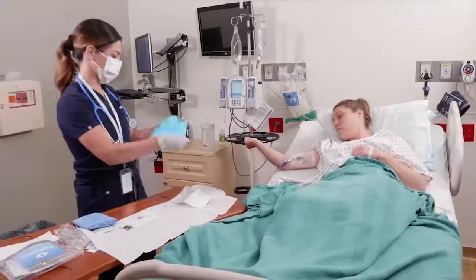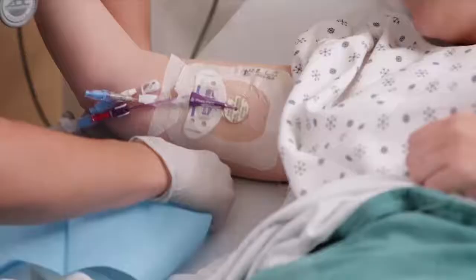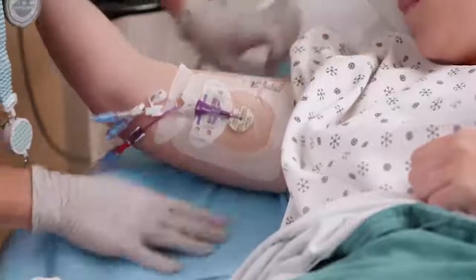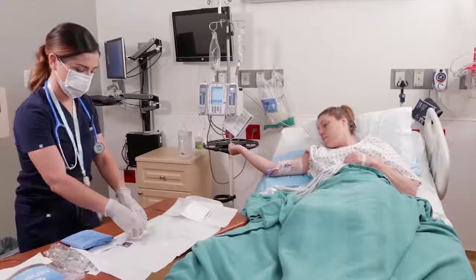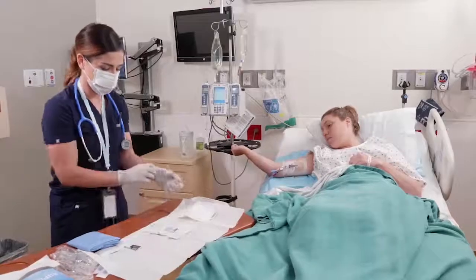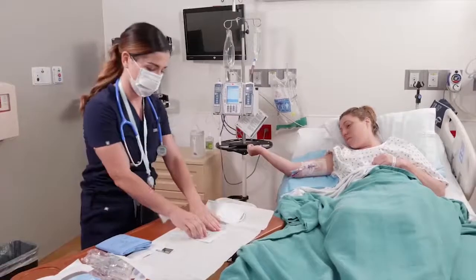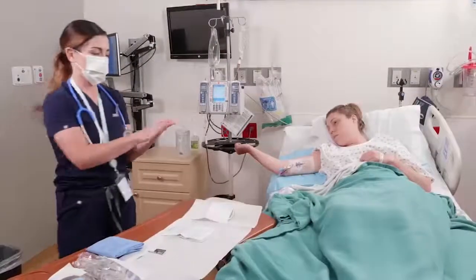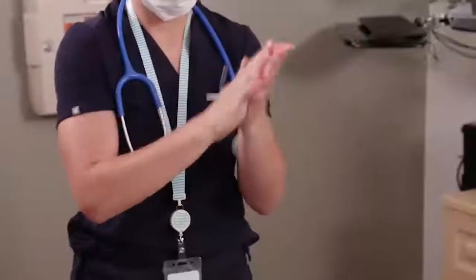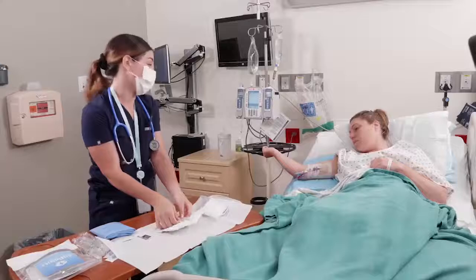Apply clean underdrape below the patient's arm. Move gown or clothing away from insertion site to reduce risk of contamination when dressing is removed. Now, it's important to change your gloves and repeat hand hygiene. And don gloves.